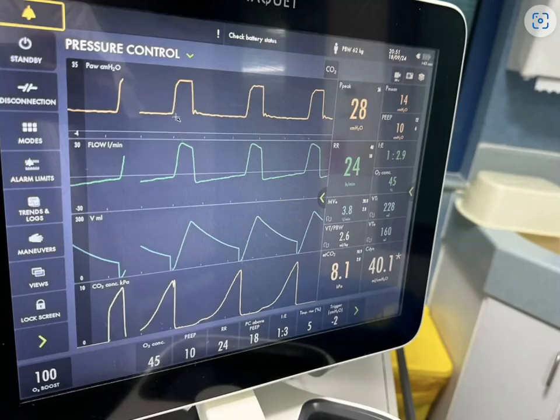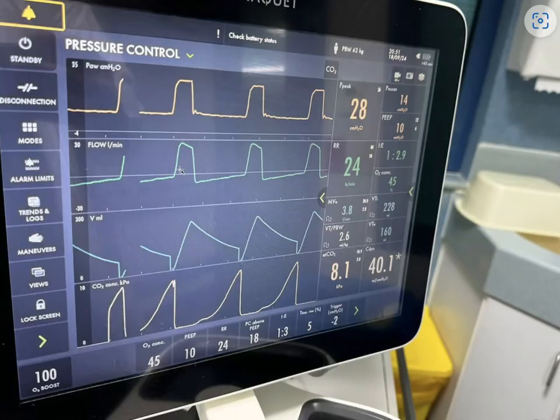Let's start with this breath — initiation of inspiration. Pressure goes up to 18 centimeters above the PEEP level and is maintained for the duration of inspiration. Inspiratory flow goes up to 30 liters per minute and then decelerates. As a result of this inspiratory flow, the volume goes up to the tidal volume of around 230 mL.